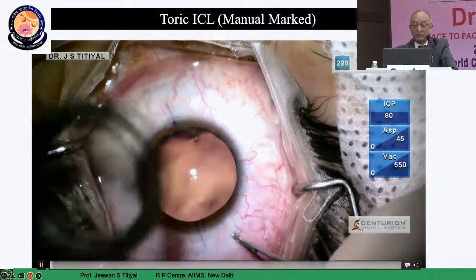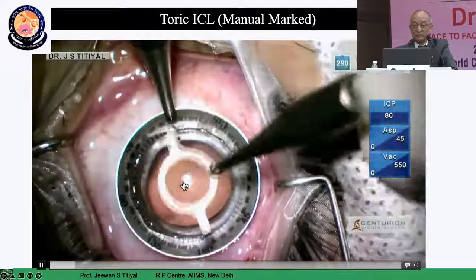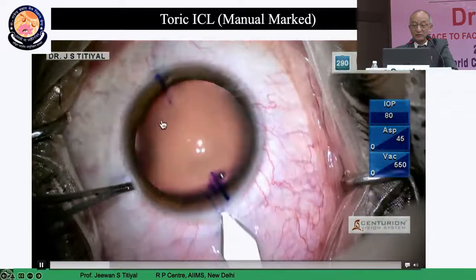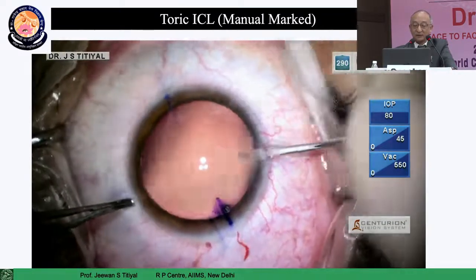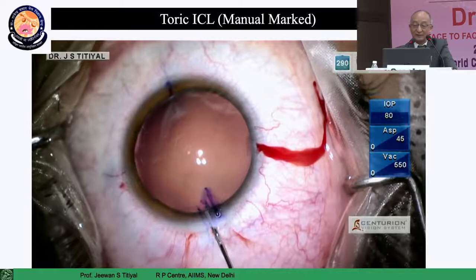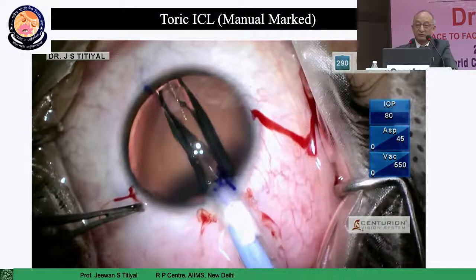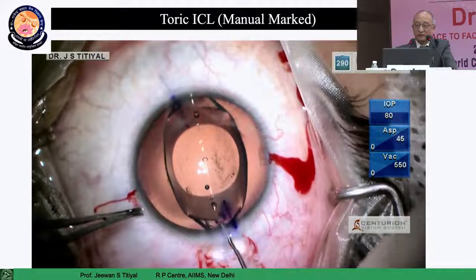To show the technique: once you have a reference marking, you put an alignment mark for the toric lens axis, which in this case is 8 degrees from the center 0-180 degree. The marking should be very sharp and clear — it should not be blurry. I make three openings: two side ports for bimanual aspiration of viscoelastic and manipulation of the lens. I normally use 1% sodium hyaluronate to form the AC before lens implantation. When you form the AC with sodium hyaluronate, the lens opening is much better controlled, doesn't open with a jerk, and will not damage surrounding structures.